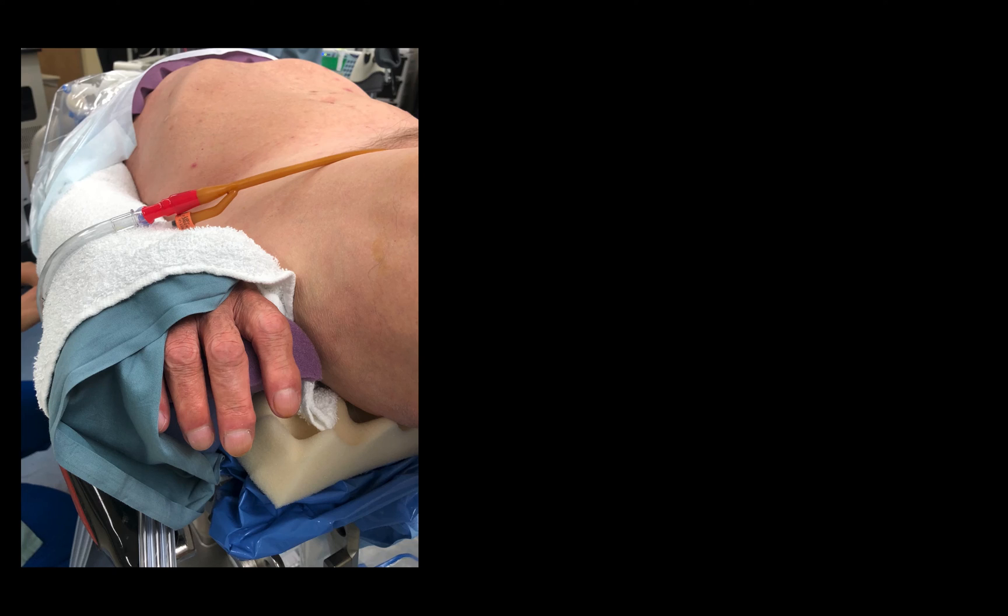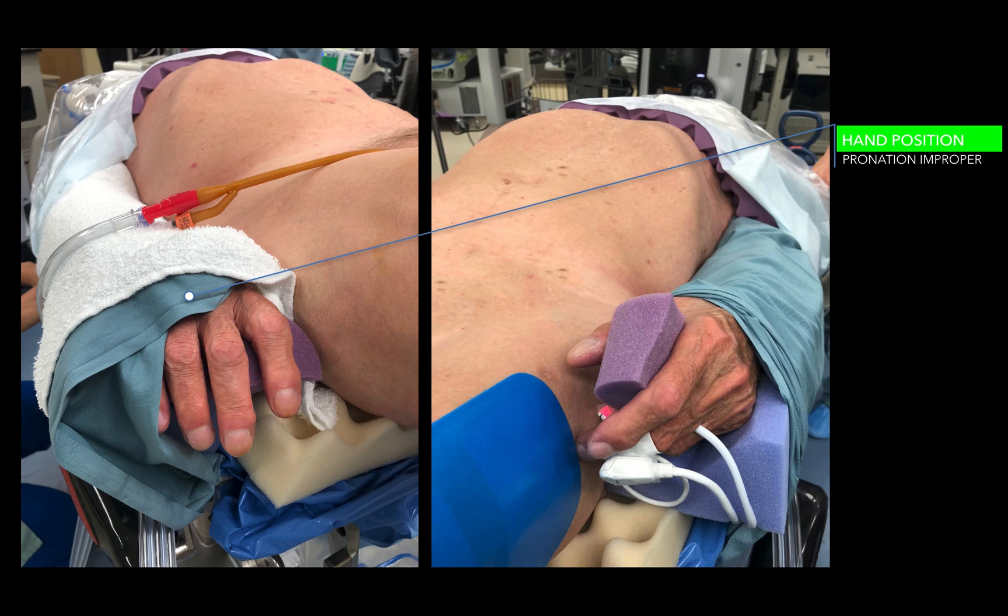I then turn my attention to the arms. Like any laparoscopic case, the arms are wrapped and placed in generous foam padding, and the tuck sheet wraps over the arm and under the mattress. The hands are kept at a neutral position — you want to place the arm in a neutral position with foam within the hand. The tuck sheet goes from underneath the patient, on top of the foam, over the arm, and tucks underneath the mattress. That's how my patient's arms are secured to the bed.